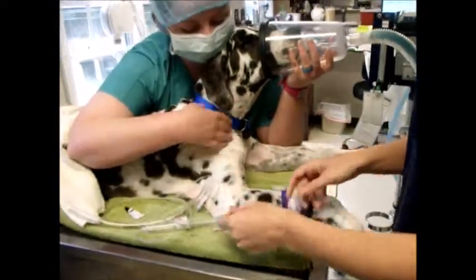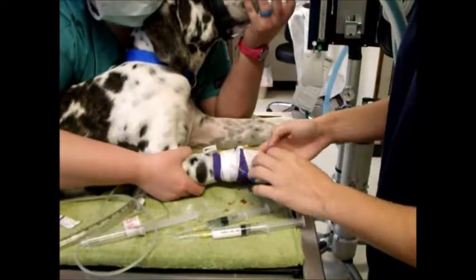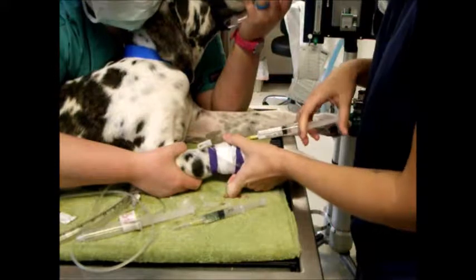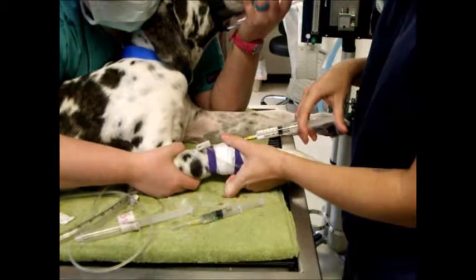I'm going to have my assistant hold her and keep her on oxygen while we're doing this. The propofol I'm going to give to effect. Usually we start off pretty slowly, and we'll give about half of this.